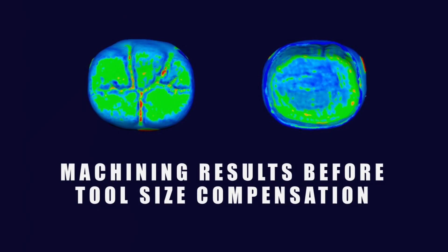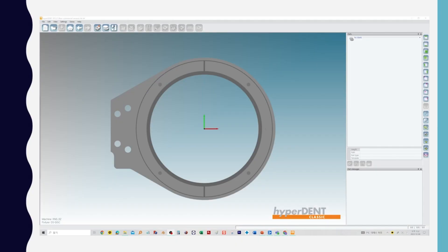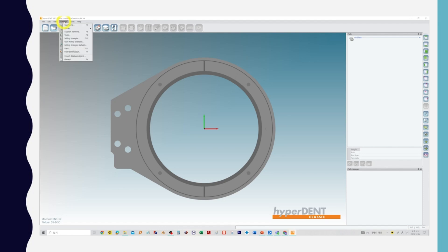Notice that the crown is machined undersized before compensating for the tool size. You can check that number and enter it into the software that calculates the toolpath to make corrections.